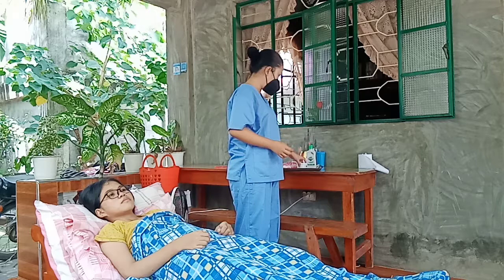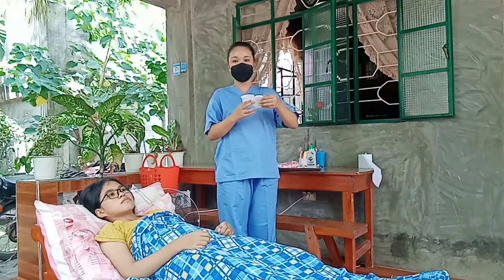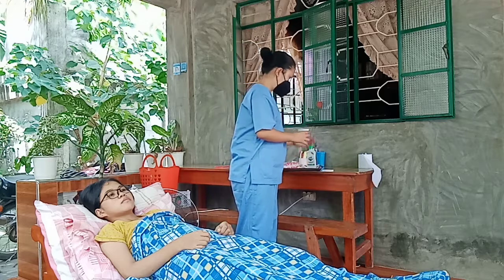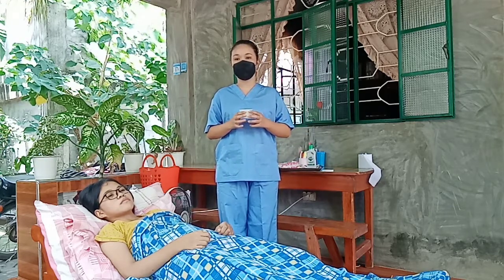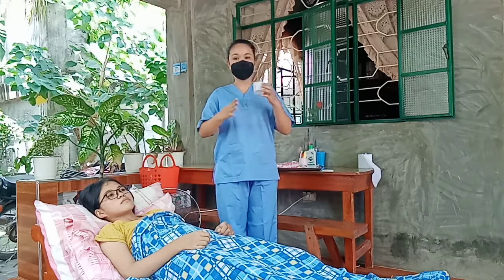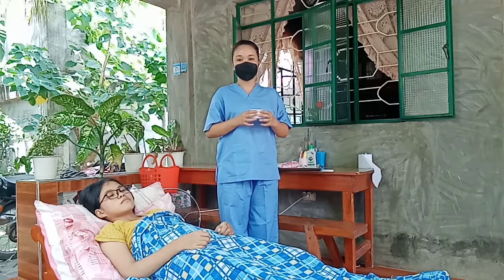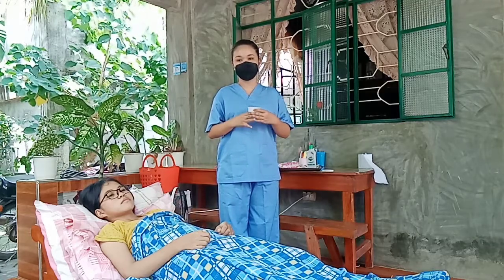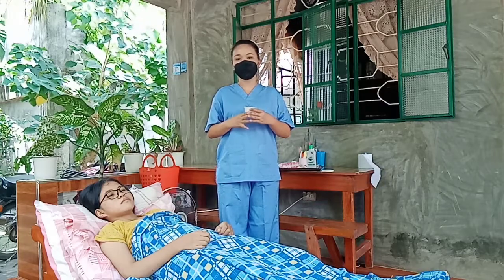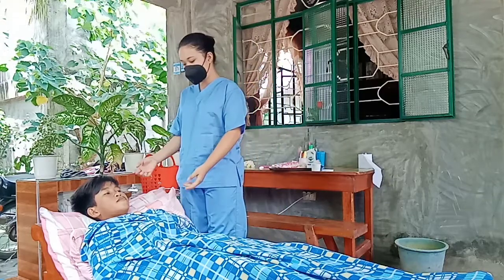So this is the container. Open the container, then place cap properly. The next is assist or allow patient to clean perineum and collect. So the patient has already cleaned her perineum, and let's just collect the specimen. Then inform patient antiseptic would feel cold. So for male patient, sir, can you stand up?